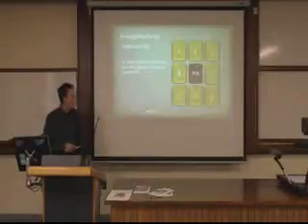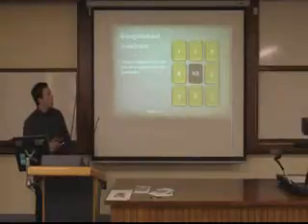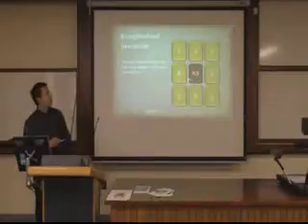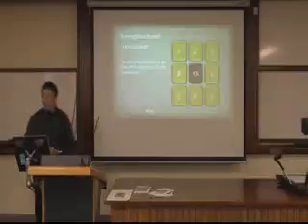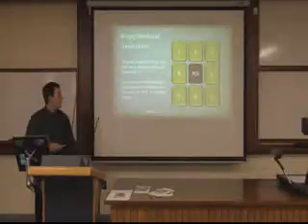Connected component labeling is basically, I use an 8 neighborhood association. It's just, if this value is white, which is 255 in a grayscale image, and any pixel around this is white, they are classed as being associated and called part of a connected component. And then you label any within the same component with the same pixel intensity value.